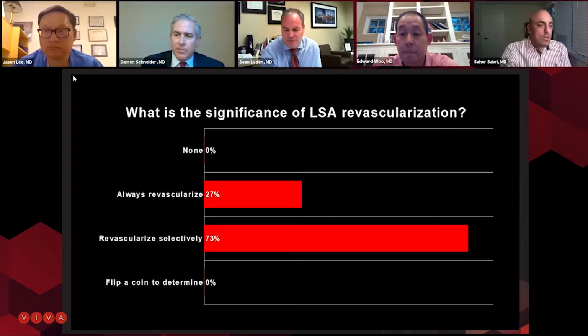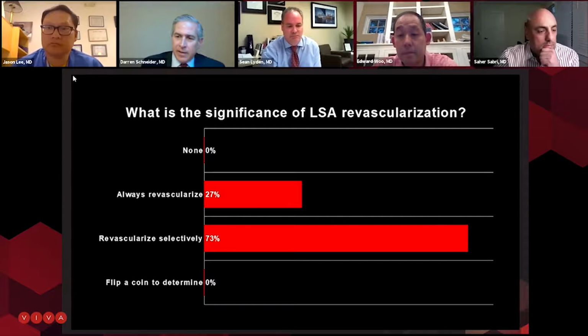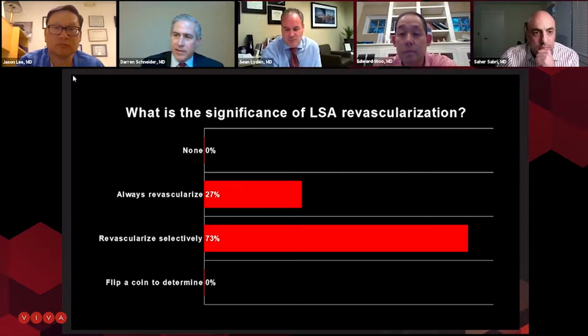Yeah, we do the same, and it is fairly straightforward. I think the exception again is going to be the urgent case, and when I do that, I usually do angiography looking at the contralateral vert to make sure there's no anomalous anatomy and that it's not the dominant vert before I cover it.